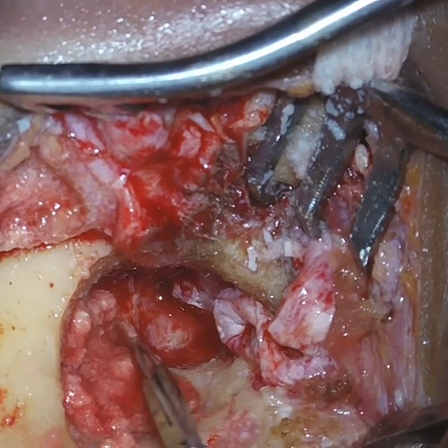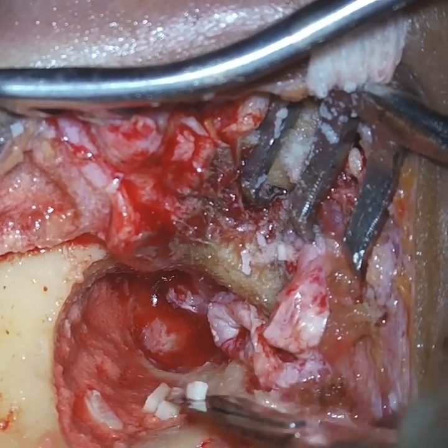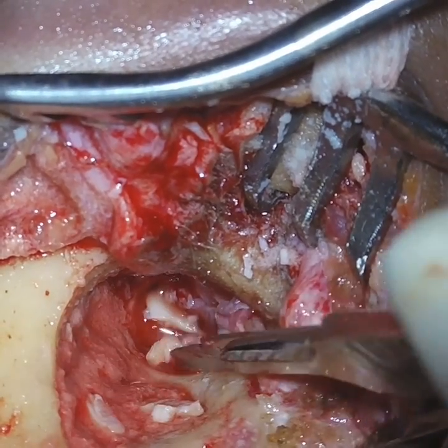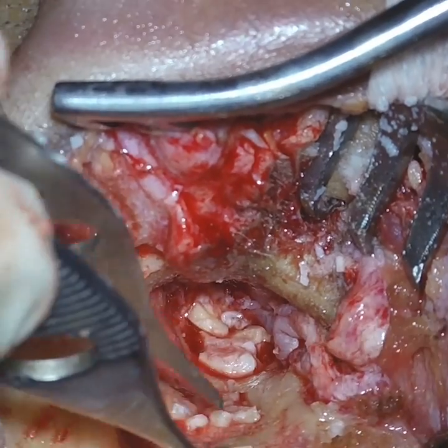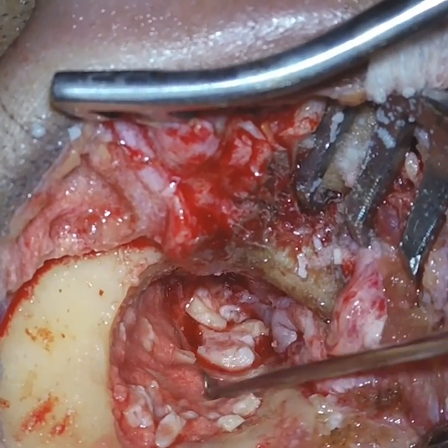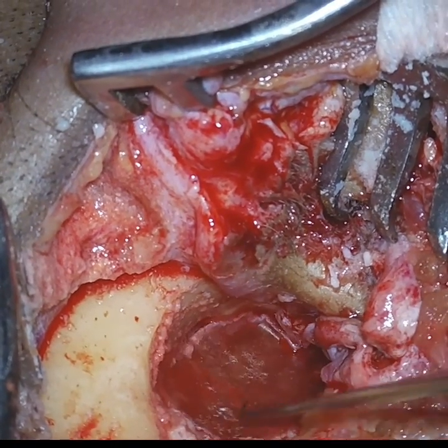There is no point in ossicular reconstruction because the patient already has a good amount of hearing loss, and that is a sensorineural hearing loss. So our aim is to give a very clean cavity so that the patient might have a chance of hearing aid use later on. So here we are just placing the tympanic membrane after obliterating the cavity fully.